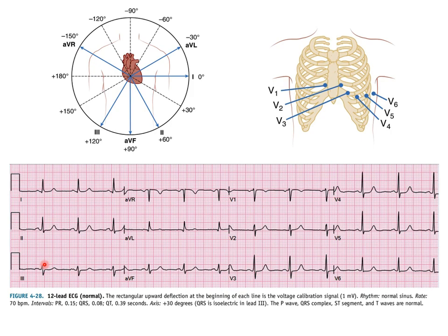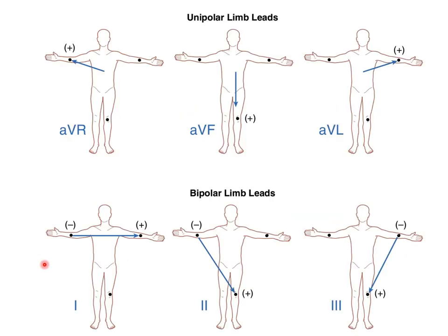So for reporting an active heart attack, this is a very sensitive technique, right? To try and generate an abnormal EKG through exercise to determine that the patient has a critical stenosis is not a very sensitive technique. People can get through it.